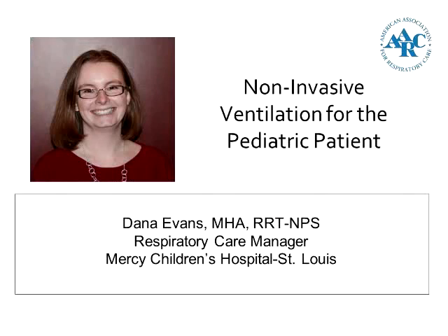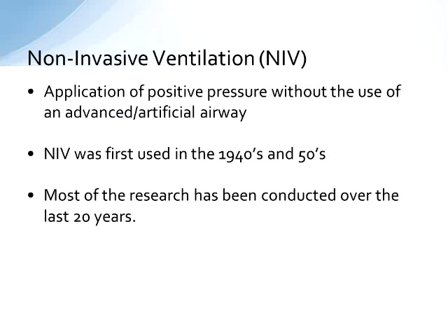Good afternoon, everyone. As Shauna said, today we're going to talk about pediatric non-invasive ventilation, some of the challenges associated with that, and some successes in some of the research surrounding this modality for this particular pediatric population. As we start, we'll begin with the definition to get everyone on the same page. I think we probably all are aware that non-invasive ventilation is simply the application of positive pressure ventilation without the use of an advanced or artificial airway such as an endotracheal tube or tracheostomy.